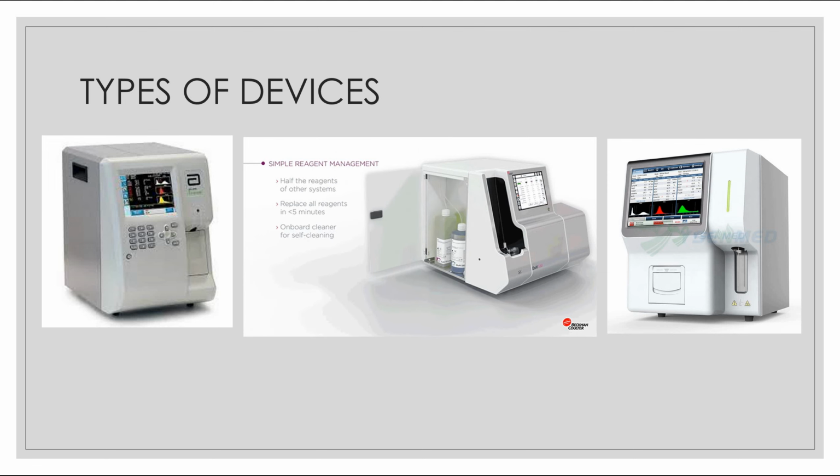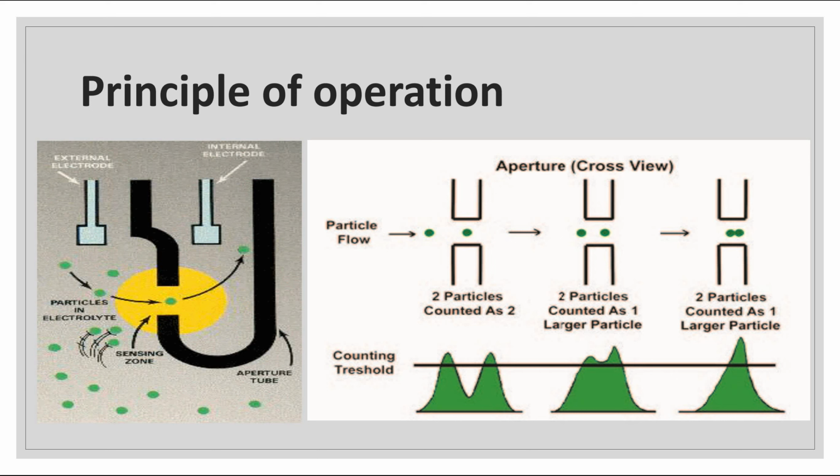What's good about these devices is that they run the test of multiple bodies in the blood to diagnose them, and it takes 30 seconds to 1 minute to give the results. So how does it do that? It's something similar to the microfluidics when you do blood testing at home.